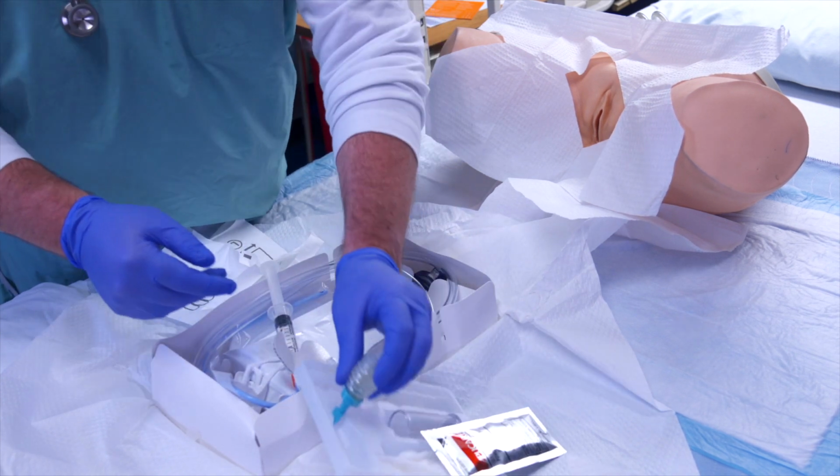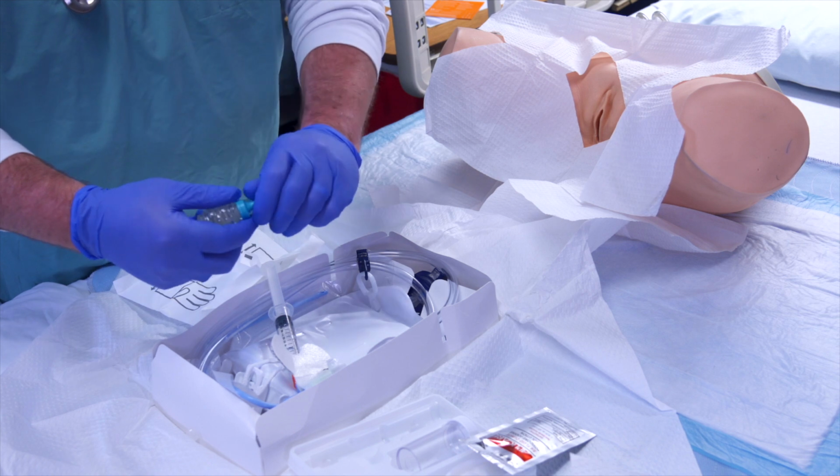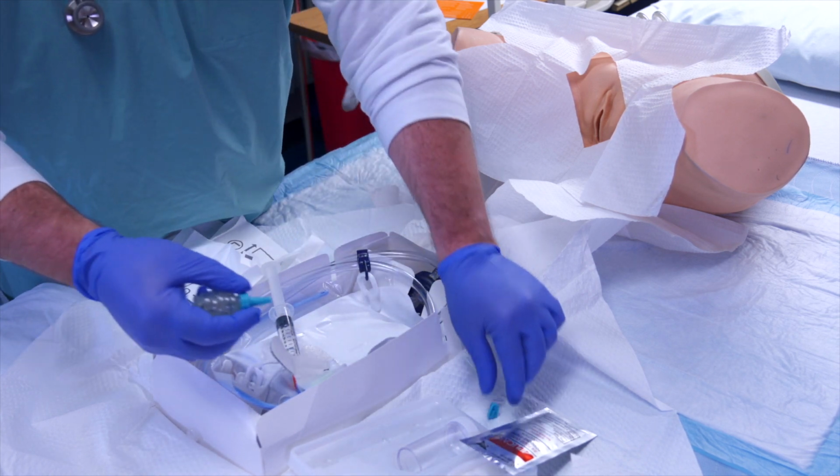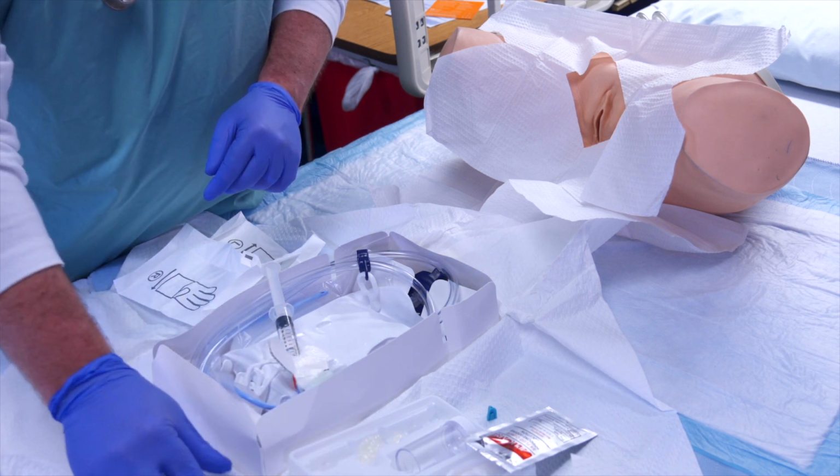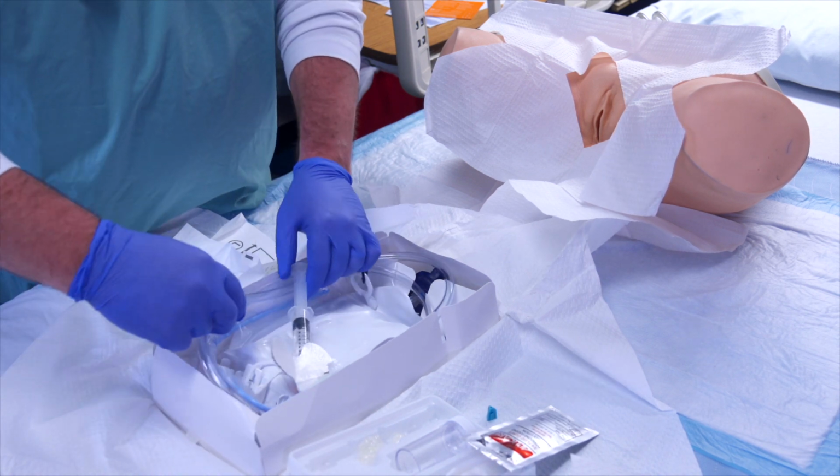From the tray, open the water-soluble lubricant and squeeze the bellows syringe into the tray compartment and discard the empty container. You may also save some lubricant in the container for placement directly into the meatus.